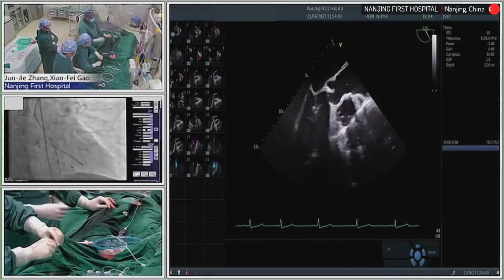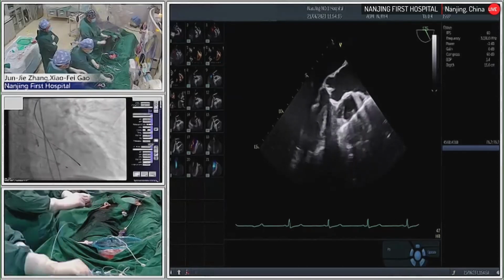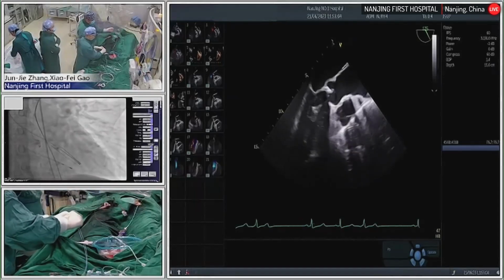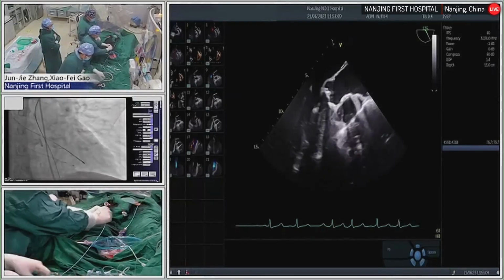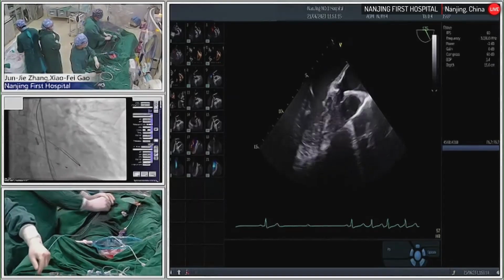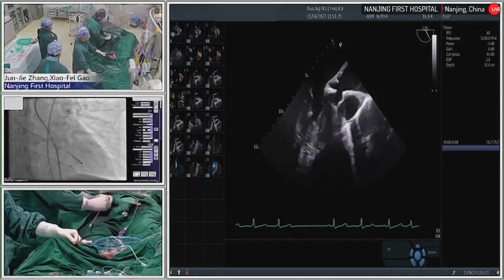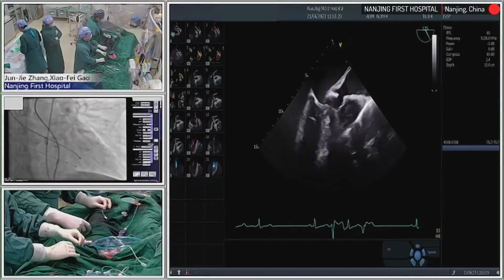Just at the ascending aorta, I will use a snare to capture the wire, then pull out the hydrophilic 300 centimeter wire to the left femoral, then exchange it with a stiff wire. So it's an integrated method. This is a fight method. But fortunately, we successfully crossed the aortic valve. Okay, congratulations. This is your final weapon for this tough case.